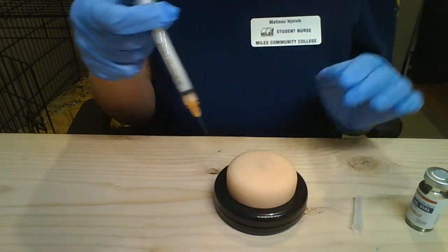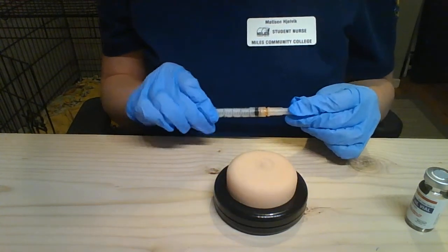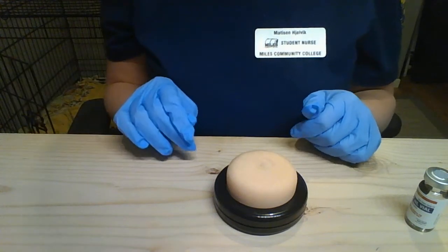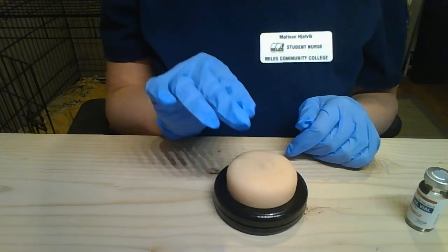and remove my needle. I would dispose of the needle without recapping, but in this case I'm going to recap because I don't have a sharps bin. Dispose of my needle, and I could put a band-aid on here or apply a tiny bit of pressure with a gauze pad if there was any bleeding. Put a band-aid on.